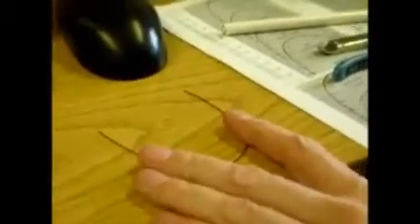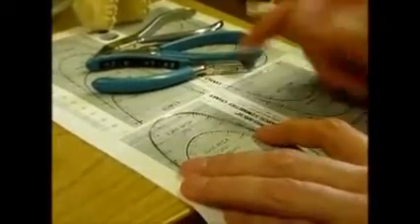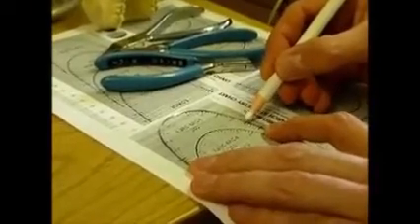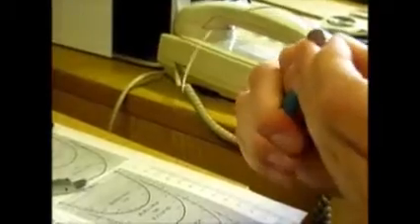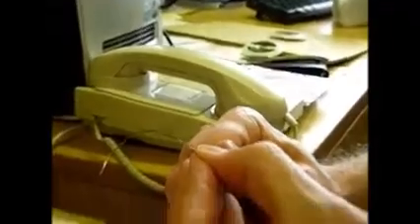So that's what you need to do, and just make sure it's flat and you've got the original arch form back at that stage. Now the next bend you need to put in is the first order bend, so if we measure up on here and we'll stick it back here somewhere, then the first order bend should be very easy: you just bend it out and you bend it back in again. That's a molar offset. That's the width of the beak. You just usually make it just a little bit. If you want a little bit of toe-in, you can. That's where this bit comes back in, but that's roughly all you've got to do.